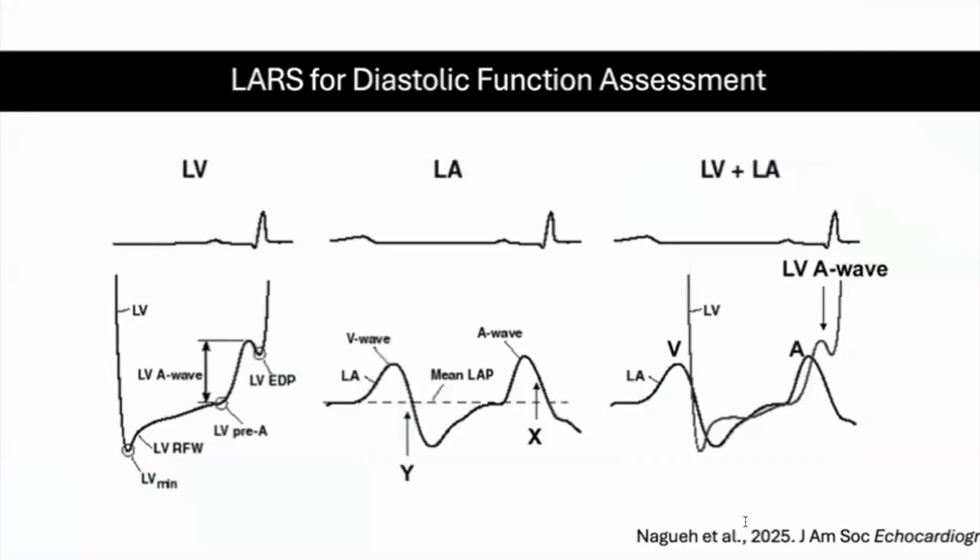So these are pulled, you know, directly from the diastolic dysfunction guidelines, which is basically just to illustrate that the underlying principle is that we know through invasive hemodynamics that there is some correlation between left atrial biomechanics and pressures and LV filling pressures, and the correlation isn't perfect, but the whole idea is to try and give us a non-invasive surrogate that can replicate what's going on with respect to LV relaxation, stiffness, and filling pressures as closely as possible.